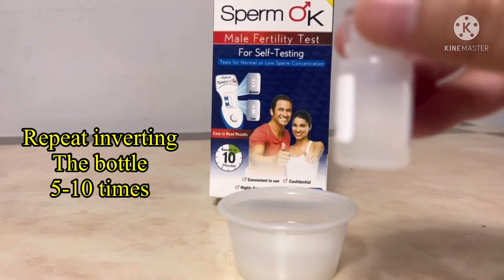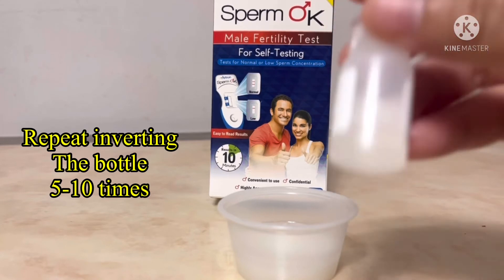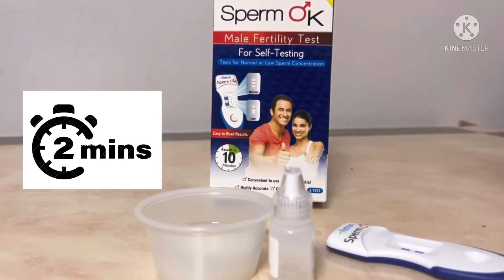7, 8, 9, 10. Set this aside for 2 minutes. Avoid shaking it.